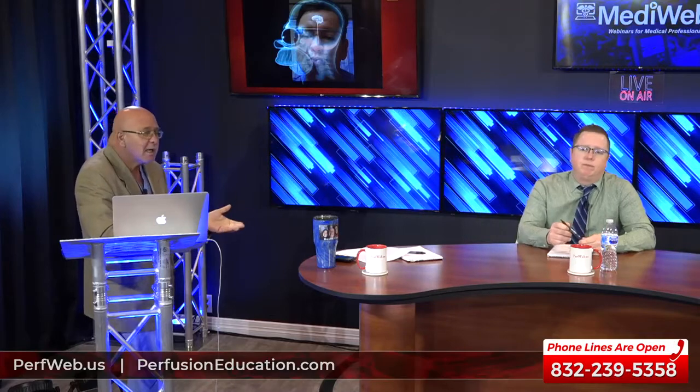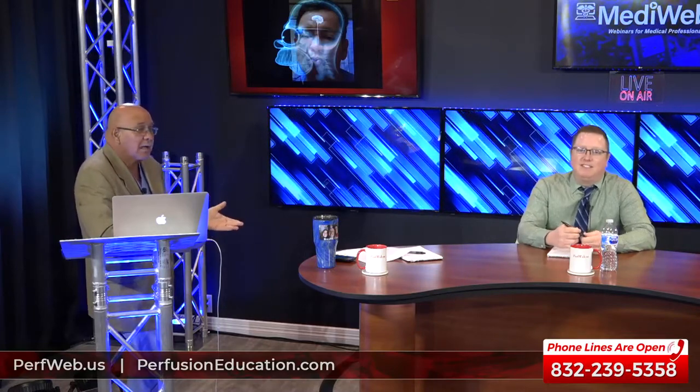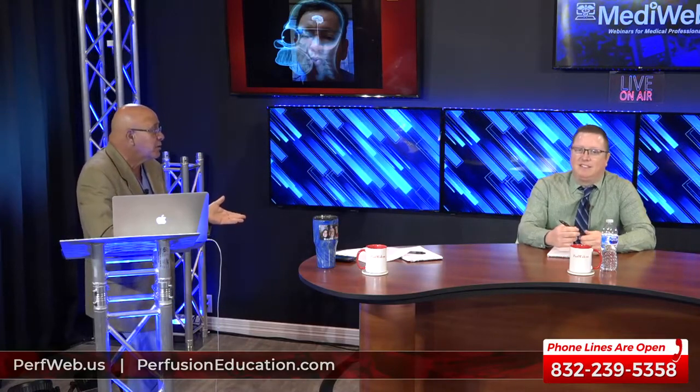But studies didn't really show a stroke reduction benefit with it, interestingly enough, even though I don't know how that's possible. That's what I was thinking, because you see a lot of big chunks. I have pictures of it with big chunks. You would have been toast. Right. So I don't understand that. I can't quite figure it out. But it is what it is.